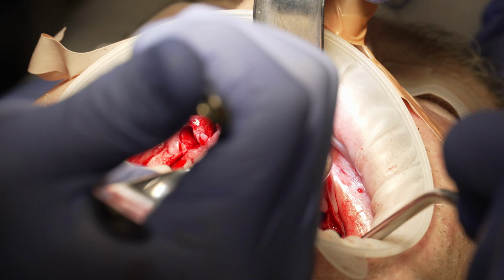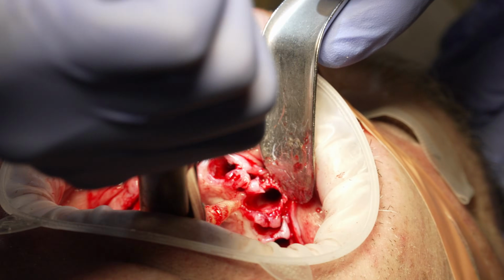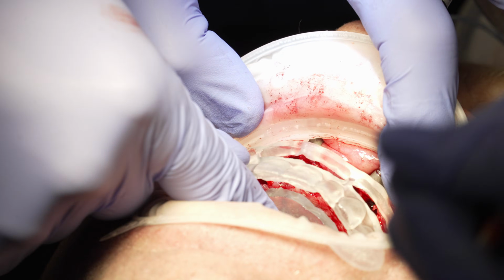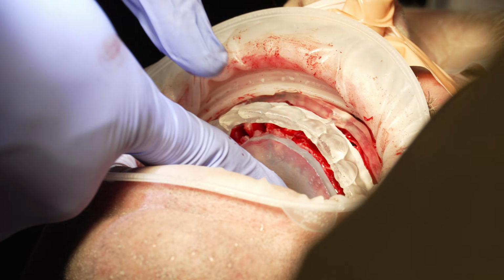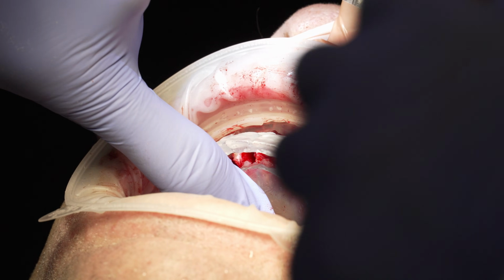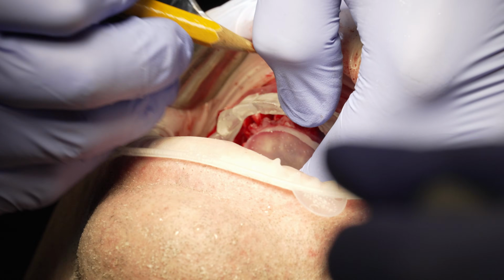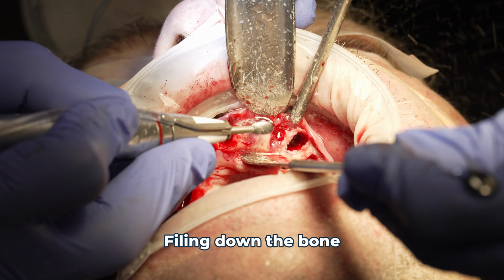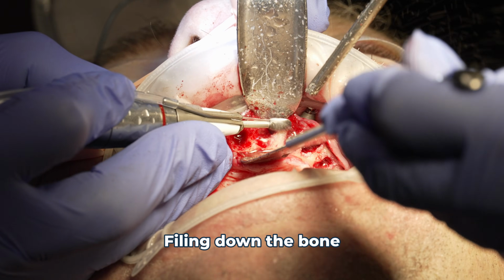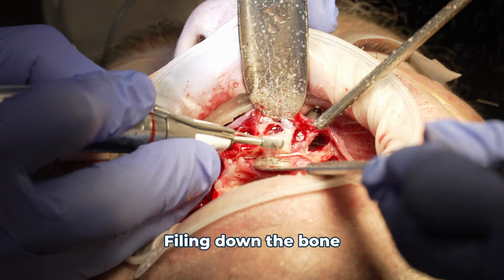And so here we're putting in place that guide that we made, and it shows us exactly where we want the bone level filed down to. And now the surgeon just marks that level in graphite, and with the gums moved back, the next step is to just start filing down the bone to the indicated level. Now this step actually takes a lot longer than removing the teeth, especially if you have a lot to do, but you get the gist of it by what I'm showing you here. And so now we have the bone level exactly down to where we want it.